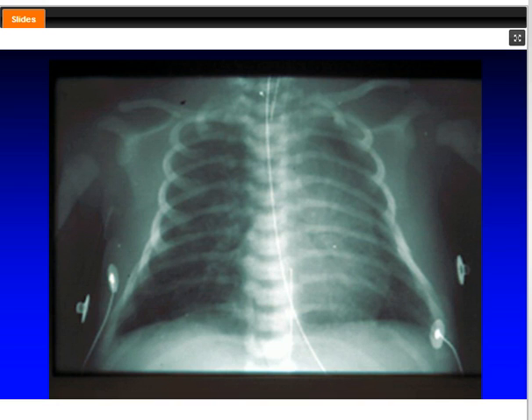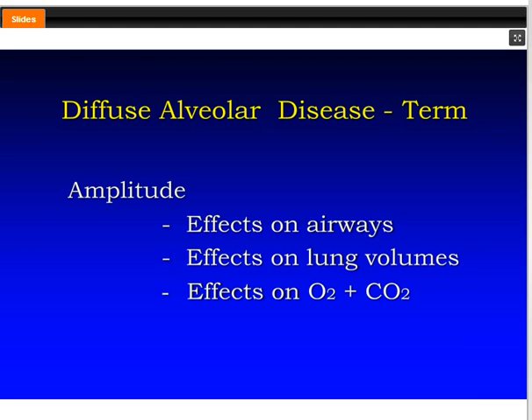From an amplitude standpoint, again, remember, amplitude opens up airways, increases lung volume somewhat. And again, you have a baby who has an atelectatic left lung. Going up on amplitude will help you open this lung from that standpoint. But remember, you don't want to be on real fast frequency, because this is probably in part due to secretions, and therefore a slower frequency and a bigger amplitude will open up that atelectatic area.